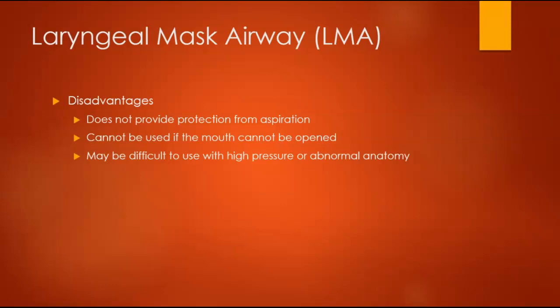So if my patient's lung compliance is really stiff, that balloon is really stiff, I'm going to need more pressure to inflate that balloon. That can cause difficulty with these. And again, any abnormal anatomy is going to make these difficult to use.